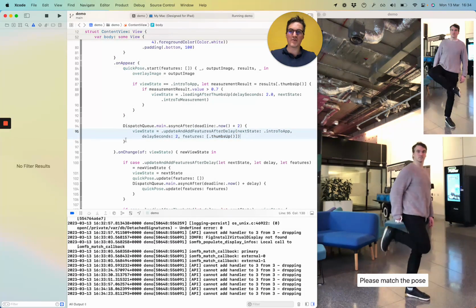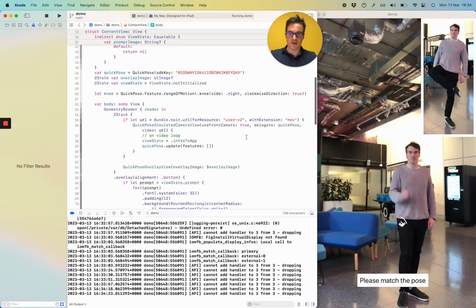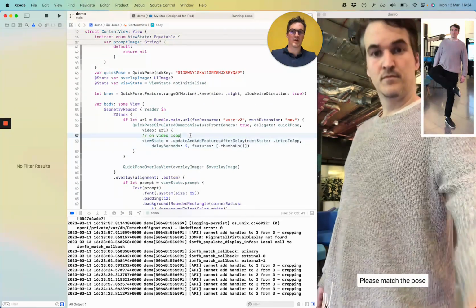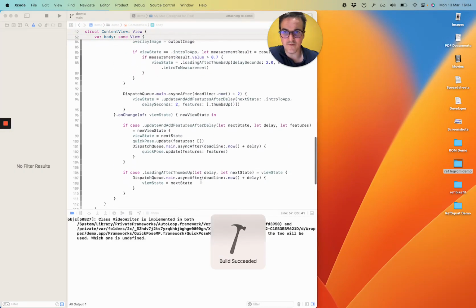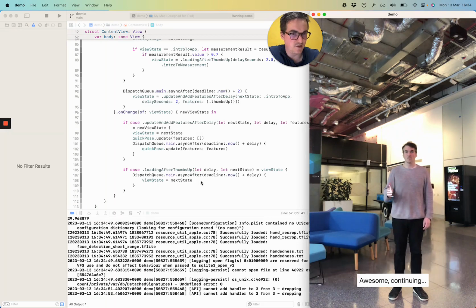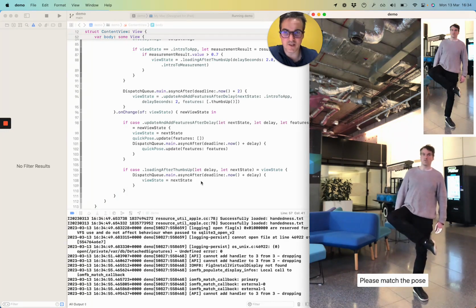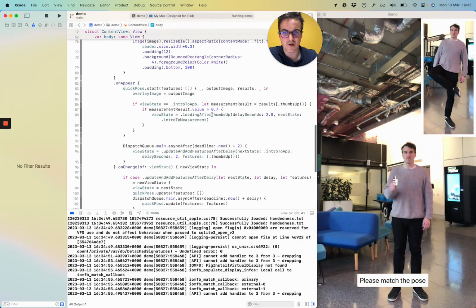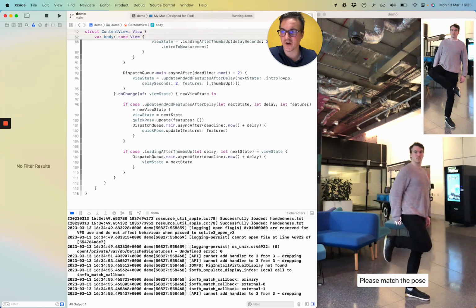Now don't forget, whenever you change it on the onAppear, you have to correspondingly update the looper. So this is on, don't forget, every time the video loops. So the meta features just give us building blocks. So we get our intro, we get our thumbs up. So the thumbs up is still present for too long, which means that after we get our thumbs up here, we're not transitioning to our correct features.